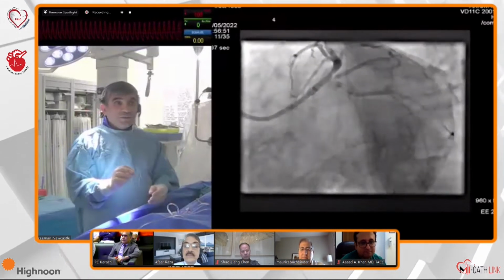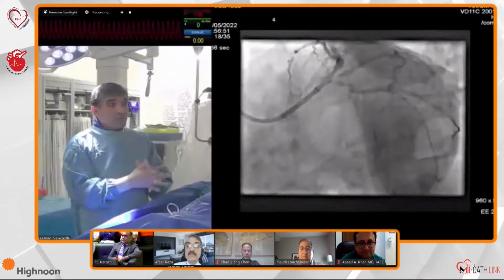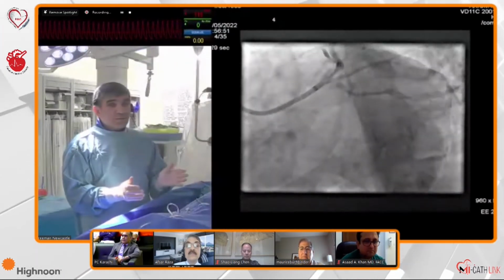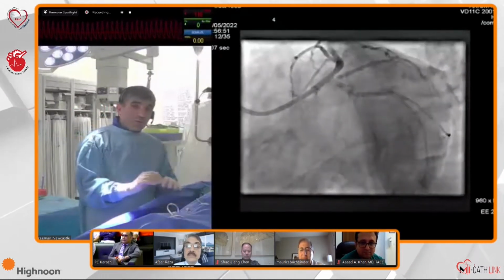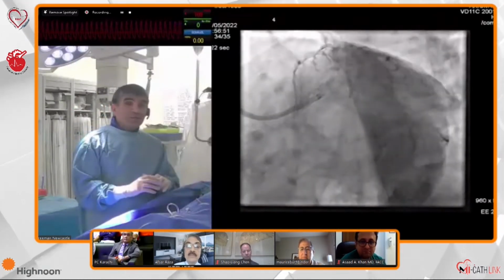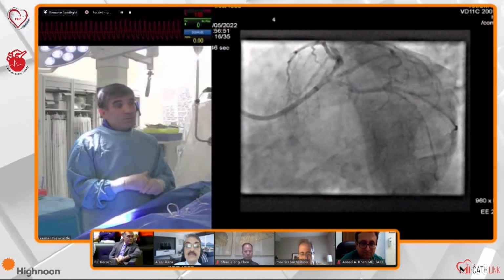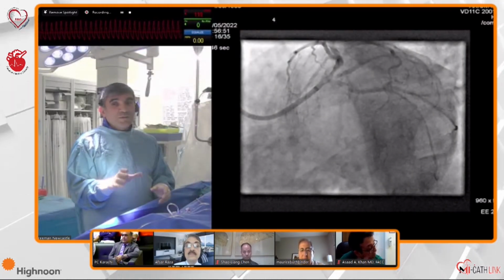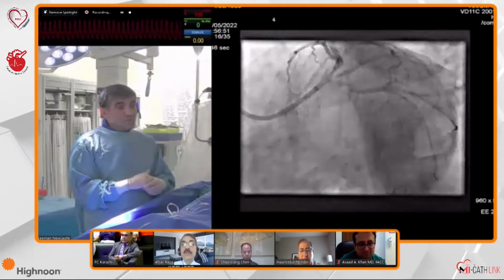The intermediate does have some disease, but luckily, as we could see angiographically, and I don't know if that's clear to you guys, the ostium is not significantly diseased at all. There's eccentric calcium and mild atheroma, which in a way makes life much easier. And to me, this is definitely a 2-stent strategy because the territory of the circumflex and the intermediate are large. So it cannot be ignored, and it is the most significant one, as you could see.